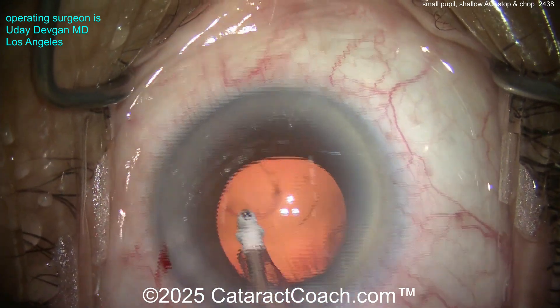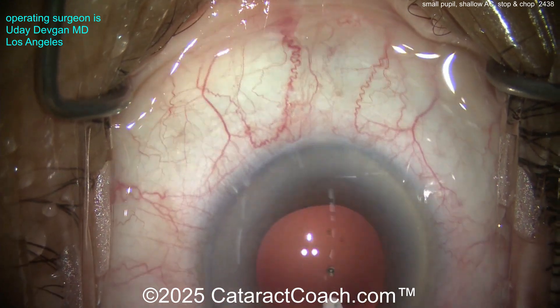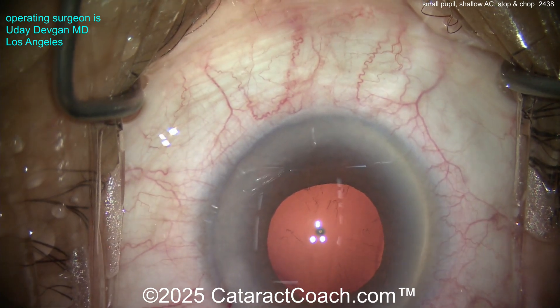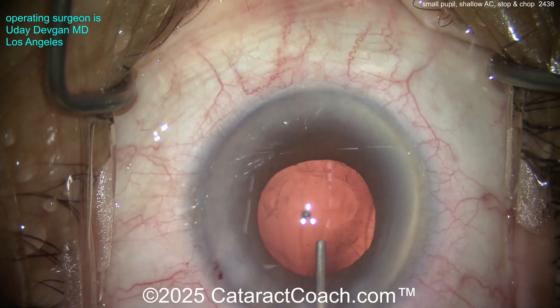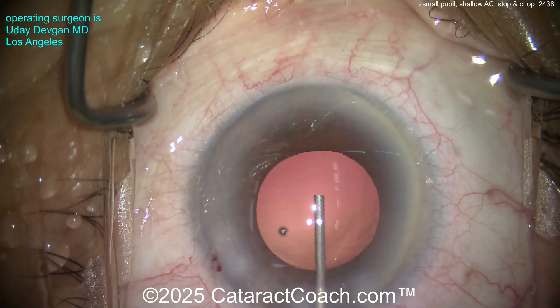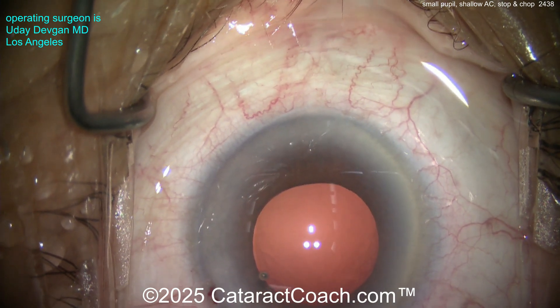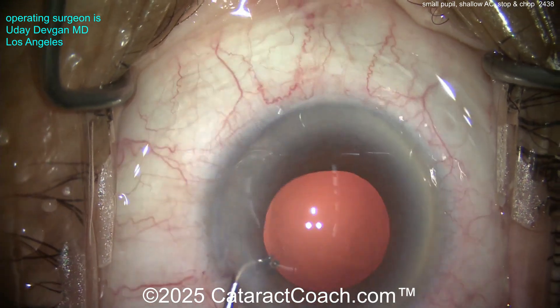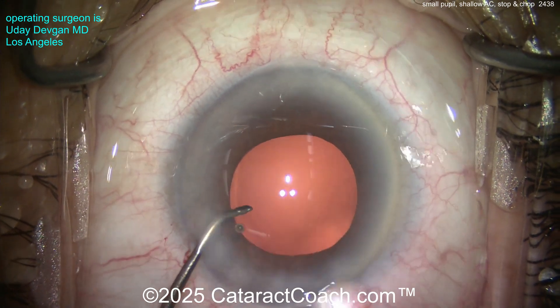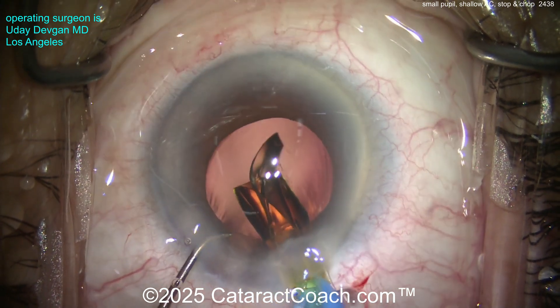The bag looks pretty clean — but can you be sure? There's that last piece. The bag looks clean, so why not put the lens in? But we have to check and make sure. Here comes the viscoadaptive cohesive agent going into the bag — filling up the capsular bag again. The bag looks sparkly clean, but ask yourself: if the capsular bag diameter is nine millimeters and your pupil is four and a half to five millimeters, how much are you actually seeing?